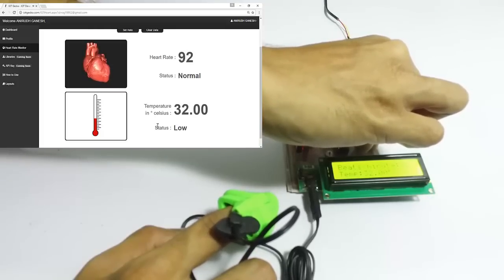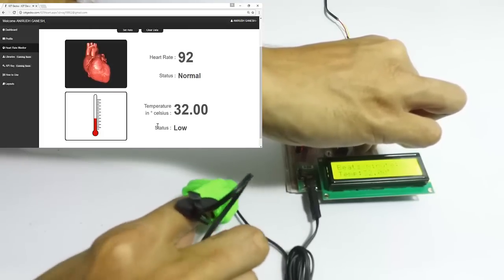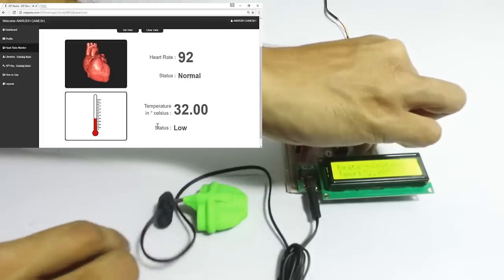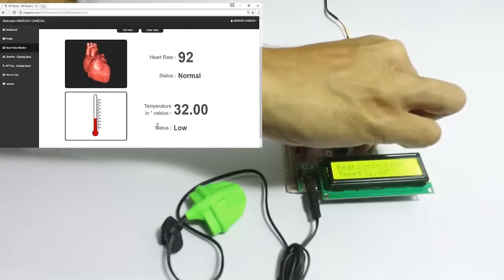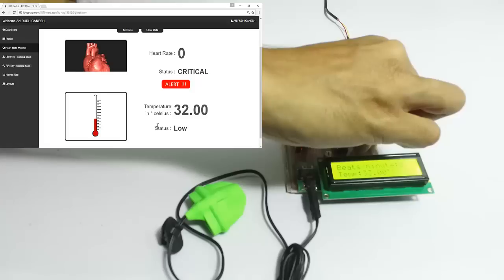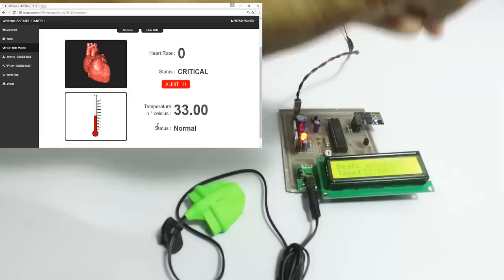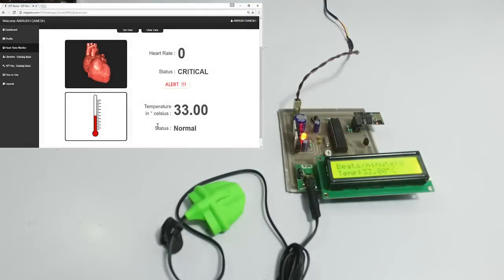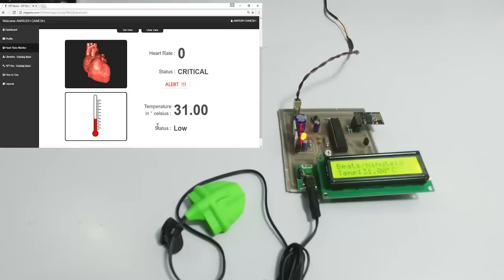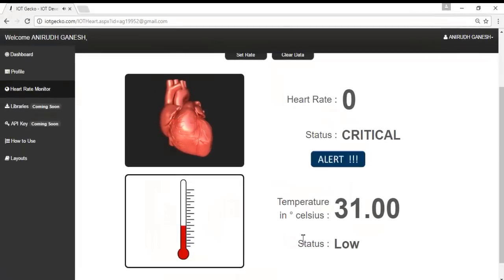Now let's simulate the heart rate as zero by removing our finger, to simulate that the patient's heart rate has gone below a particular limit. Similarly, if the temperature goes down it also displays a temperature alert that the patient's body temperature has gone below the threshold, and also sounds a buzzer. This is how the system works.